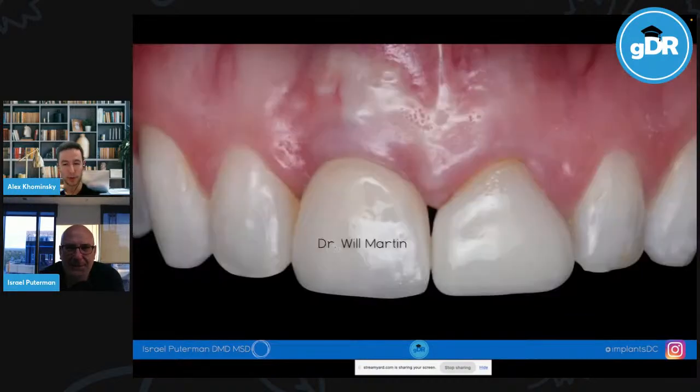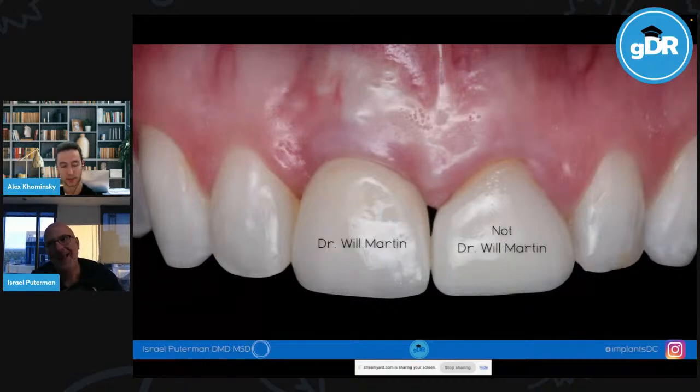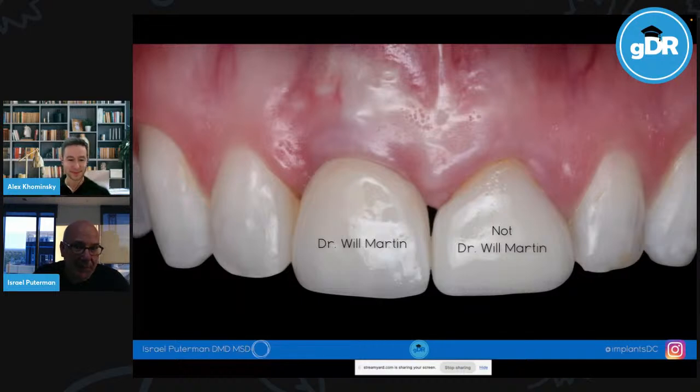Just out of curiosity, when you are seeing new patients, they're all getting intraoral scans, I imagine? They're not. It really depends. We talk about that often in the office, that every new patient should have intraoral scans. Well, implant patients, say. Okay, well, I would love it, frankly, if it was every patient. But one of these years. Every implant patient that I'm going to be making a surgical guide for.